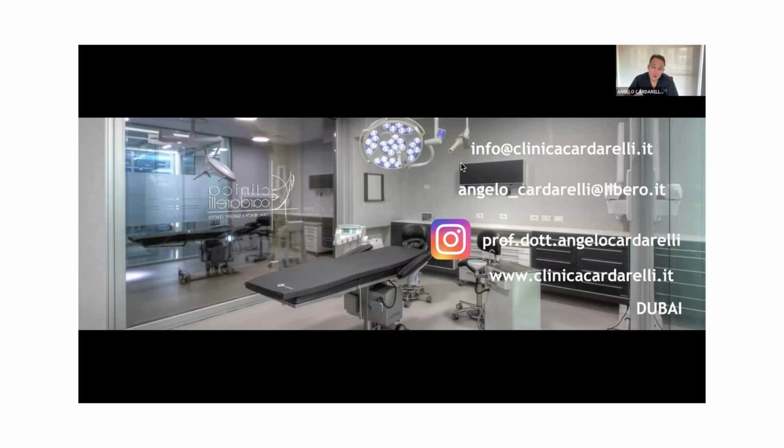I think you can ask AB Dental for sure. You can take some impression of the soft tissue just to understand the thickness, but anyway, if we have a standard multi-unit abutment in terms of the height, you can manage with the suture and you can manage the tissue during the surgery.